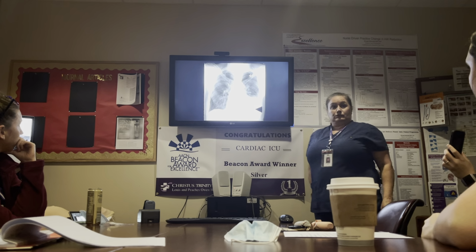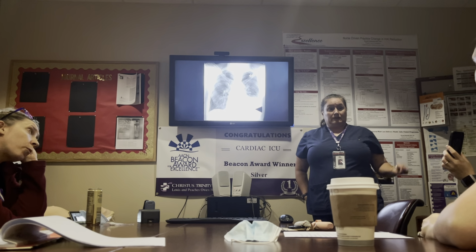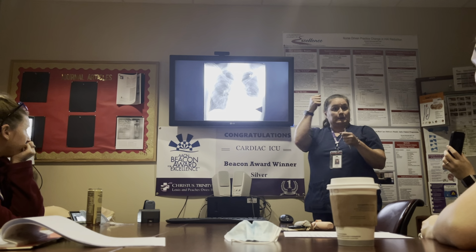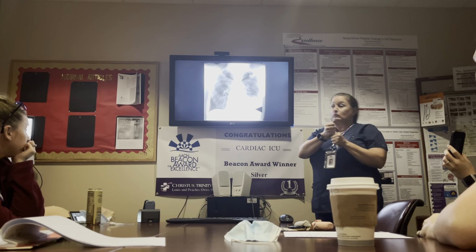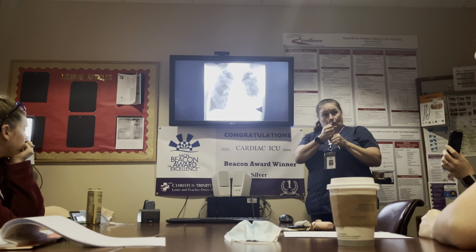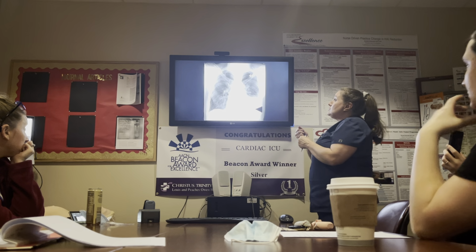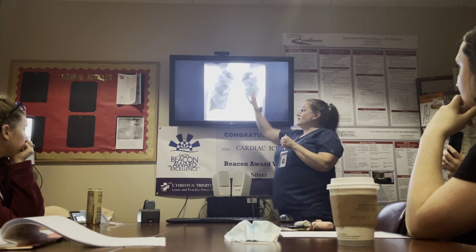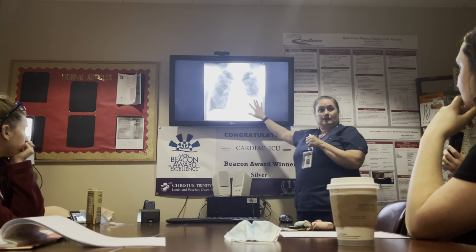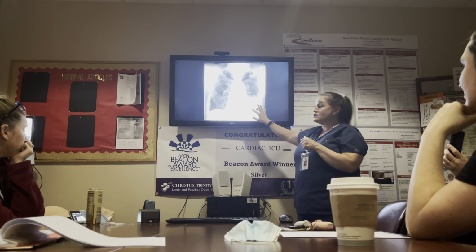We get Ivor Lewis cases in here, right? So what had they done? They basically pulled up the gastric stump and reconnected from that aspect, okay? This is actually a Boerhaave patient. Boerhaave meaning that they retched and then ruptured their esophagus, okay? So you're gonna see air and you're gonna see salad down here of whatever was in their stomach when they were retching, okay?